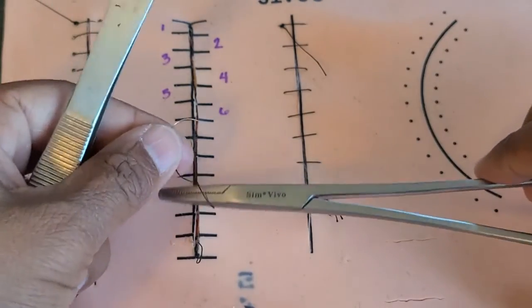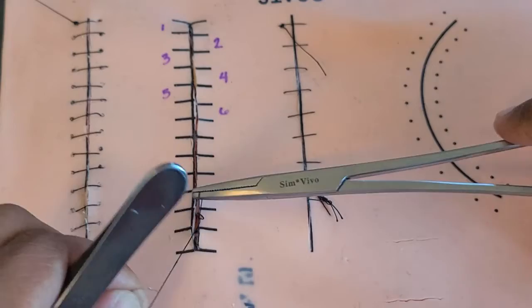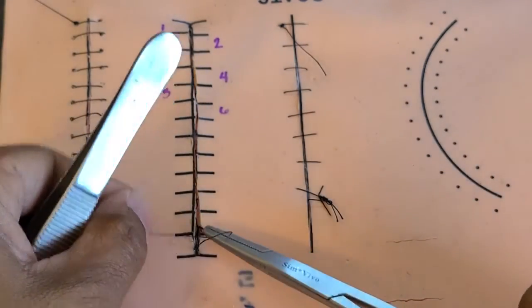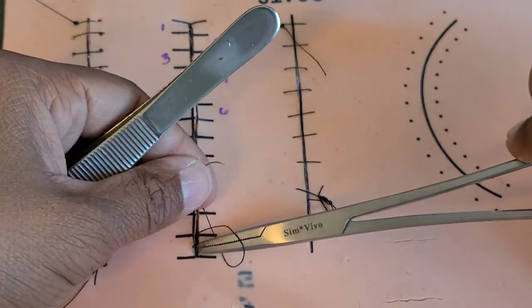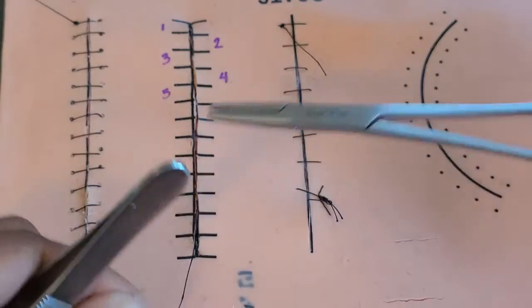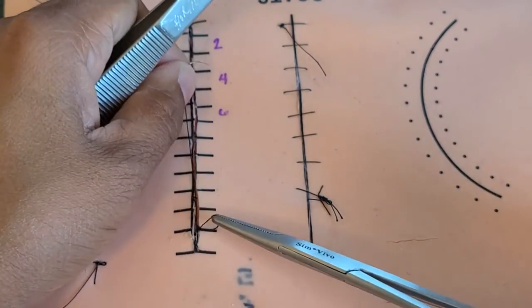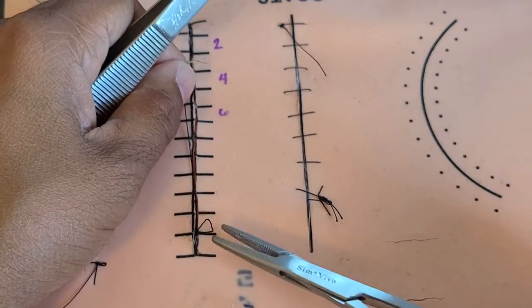Just like how you've learned to instrument tie, you double your knot: away, toward, away. Some people will actually cut this little loop.